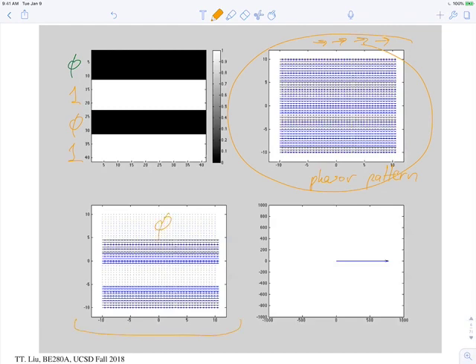You can see it's 0 out here, because when I multiply my object by my phasor pattern, I just get zeros where there's no spins. And this is the summation of all that. All these things sum up, and so I get a fairly large value, because there is a mean value here. This is right now at the center of k-space, so this is G of 0, comma 0, and it's a medium large number. And remember, the center of k-space is just the area of that object.